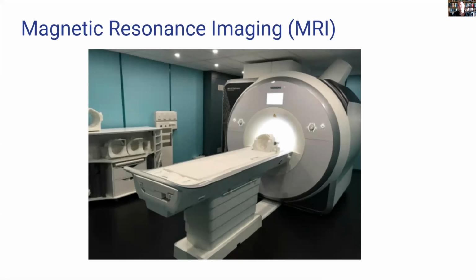So for those of you who are unfamiliar with what an MRI looks like, it is this great big machine here. As you can see, a patient is put into the gurney and then popped into the machine, which contains a very, very high magnetic force field.